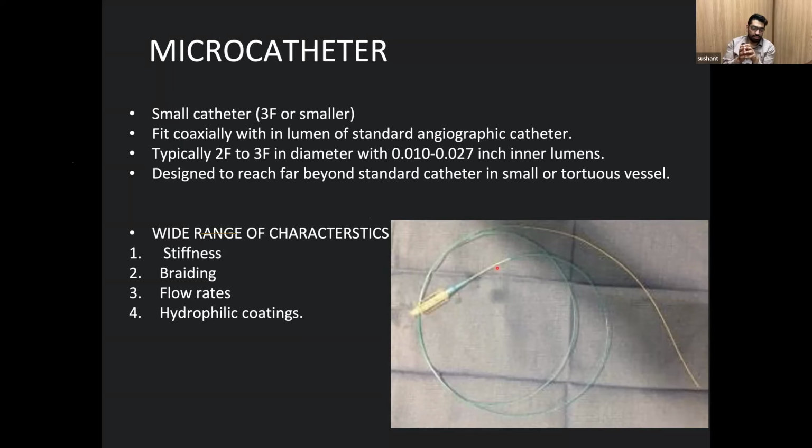Now coaxial, we have understood one thing goes through another thing, it is known as coaxial. So this coaxially fits into a guiding catheter, and this micro guide wire guides this micro catheter to the very distal most positions, and we can navigate from SMA to jejunal artery to even the level of vasa recta. So we can reach precisely, super selectively, into the arteries and do our interventions.